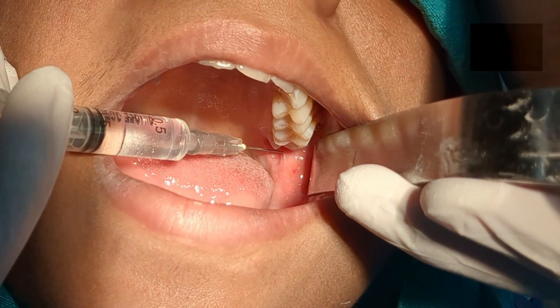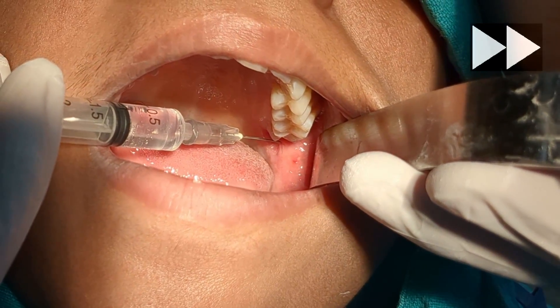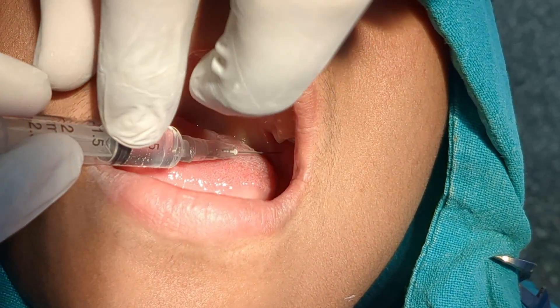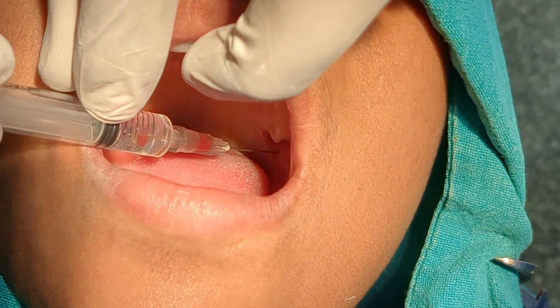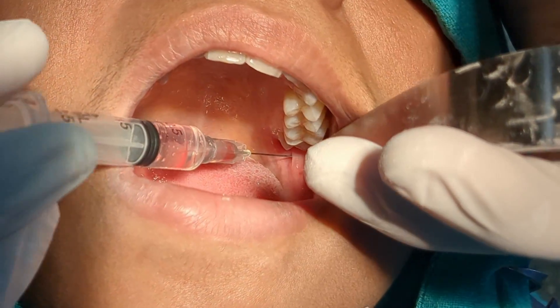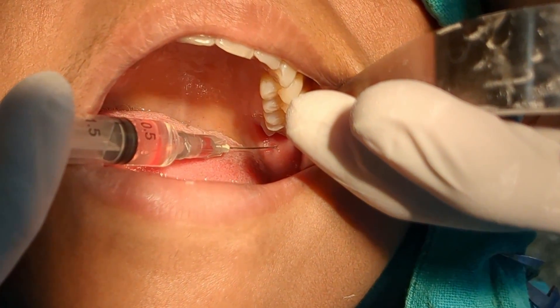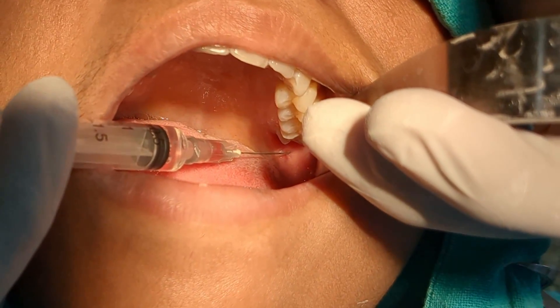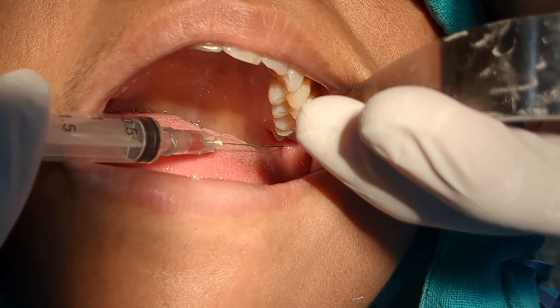Keep in mind that I have not discarded the syringe with positive aspiration — I will use that syringe for local infiltration. For the lingual nerve block, I withdraw the needle up to half the length and aspirate. You can see there is a drop of blood that came in on aspiration. This is mostly because of the bleeding from the earlier positive aspiration into the pterygomandibular space. The fact that there is no active influx of blood in the syringe means the needle is not inside a blood vessel, so local anesthesia can be deposited safely.